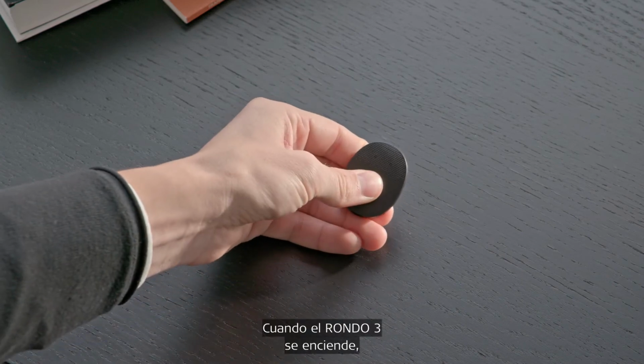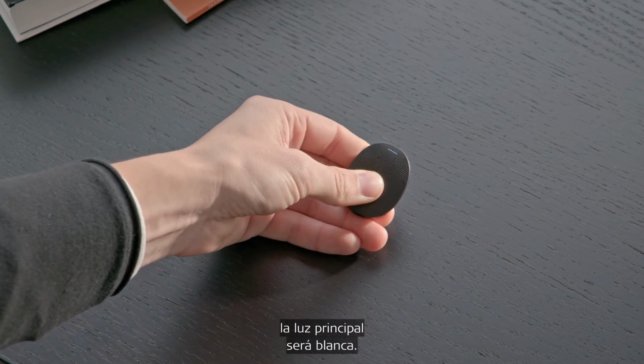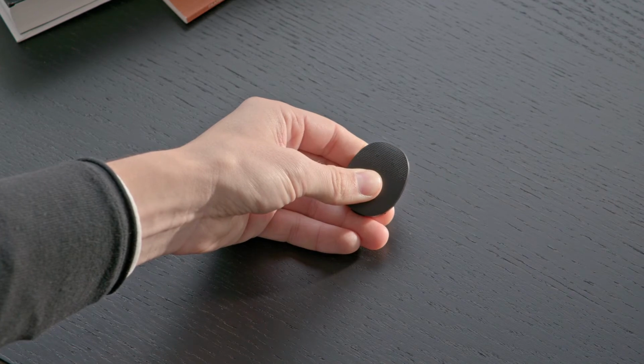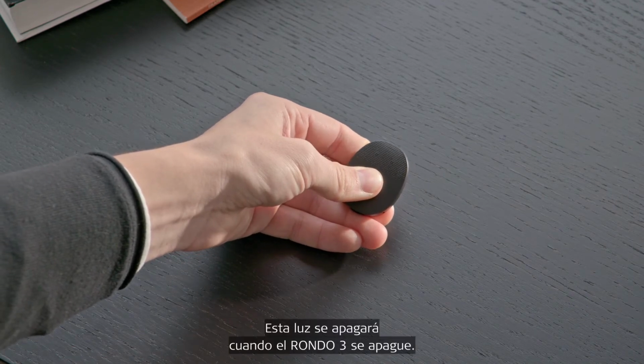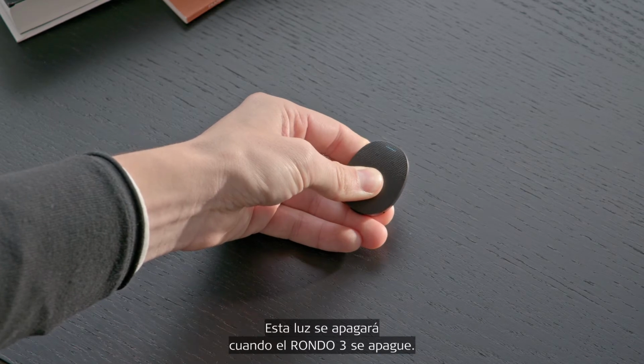When Rondo 3 is switched on, the main indicator light will fade to white. This light will fade out when Rondo 3 is switched off.